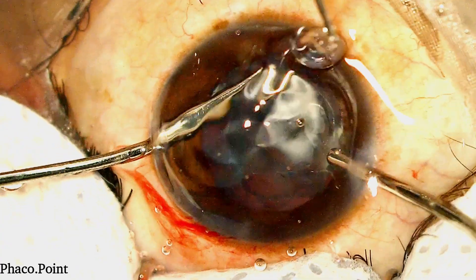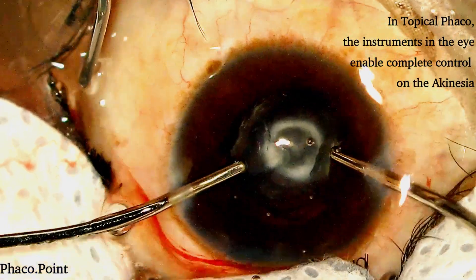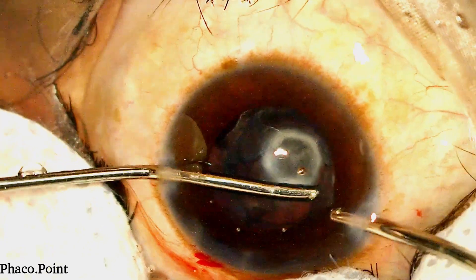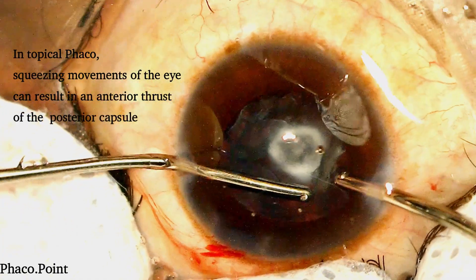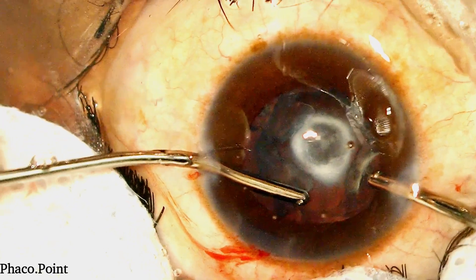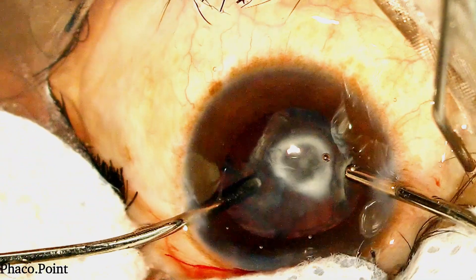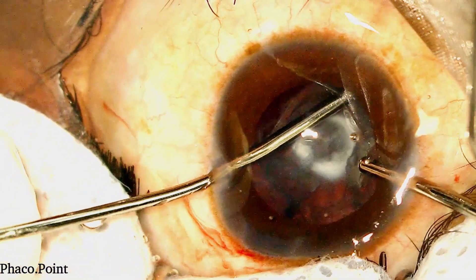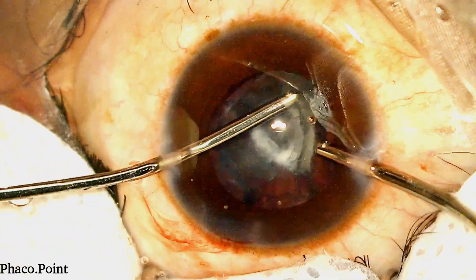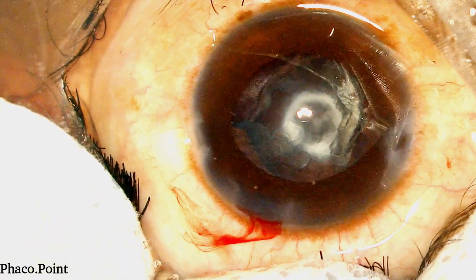Remember that this case has been performed under topical anaesthesia. As long as your instruments are in the eye — either the phaco probe with a second instrument or the bimanual irrigation aspiration cannulas — we have complete control on the akinesia. It's important to be mindful that sometimes squeezing movements of the eye can cause a resultant upthrust of the posterior capsule. We now watch the removal of this epinucleus. Note how the epinucleus is being released on all sides and drawn out to the centre. I once more perform a viscofluid exchange to ensure that I do not let the anterior chamber shallow and the posterior capsule rise.